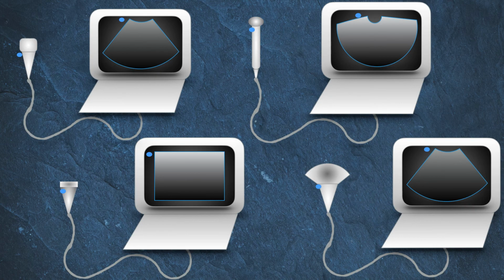These are very rough schematics of ultrasound probes or transducers which you may use. The upper left is the phased array transducer. It has a square face, which is in contact with the patient's skin directly, and it is a low-frequency probe. You may use it for most thoracic and abdominal imaging.